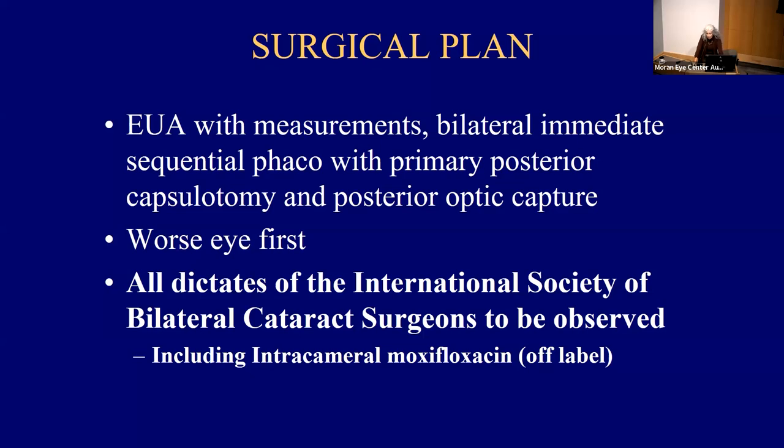And no way he's going to sit for a YAG, so that would have to be a general anesthetic for the YAG as well. After a long conversation with family, we decided not only to do his brunescent cataracts, but to do a sequential same-day surgery, as well as posterior optic capture with a planned posterior capsulorhexis for both eyes. Assuming all goes well with the first eye, we were going to do the same with the second.